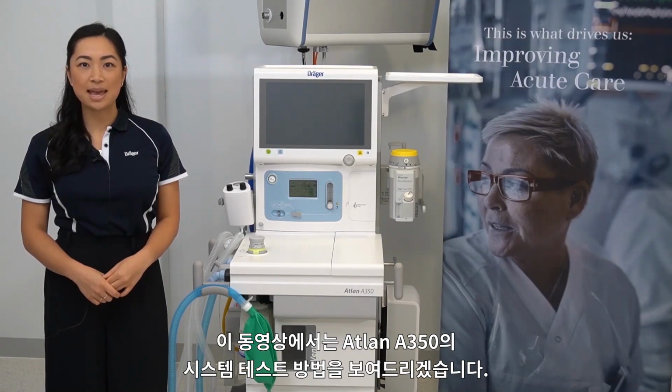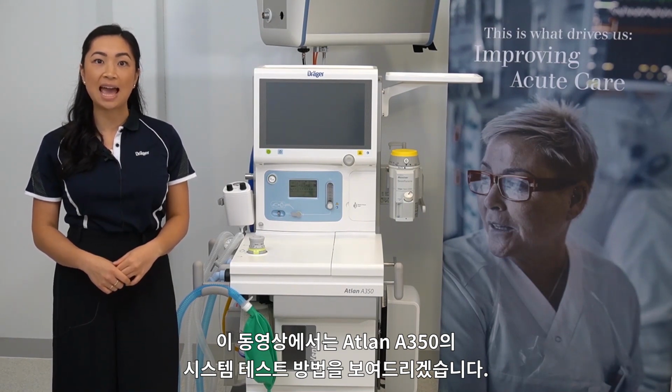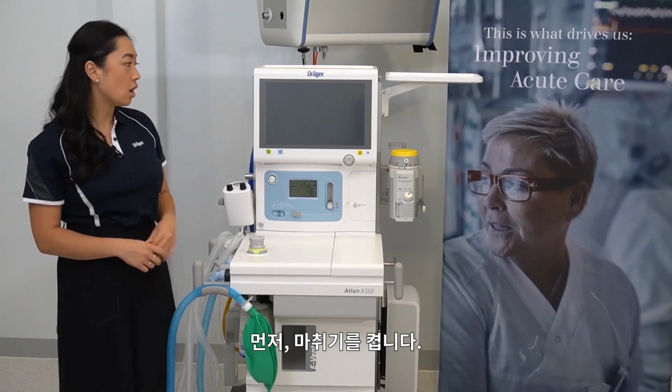Hello, my name is Samantha, and in this video I'll be walking the user through the system test for the Atlan A350. To start, turn your device on.